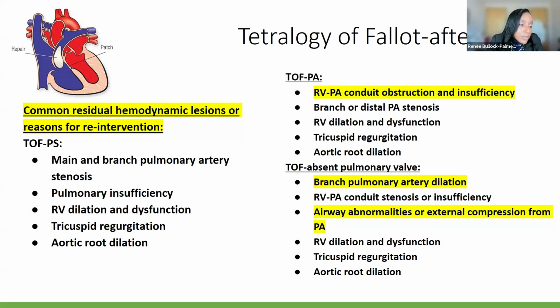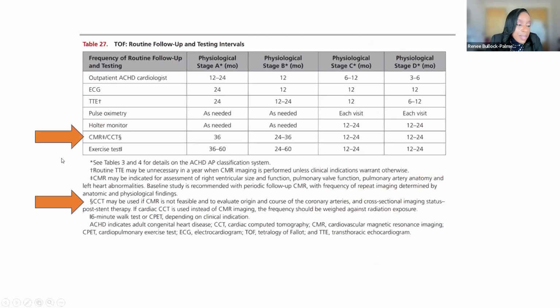They may develop restenosis of that RVOT. So there are lots of complications that these patients can have, and even they can develop dilation of that aortic root because they have that large overriding aorta. So those are some of the complications that these patients can have. And CT, CMR play very vital roles in looking at these patients.